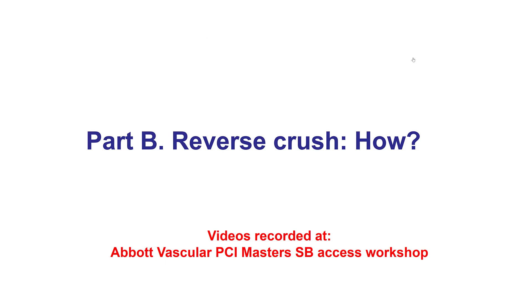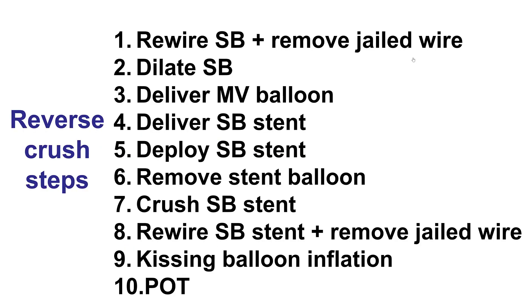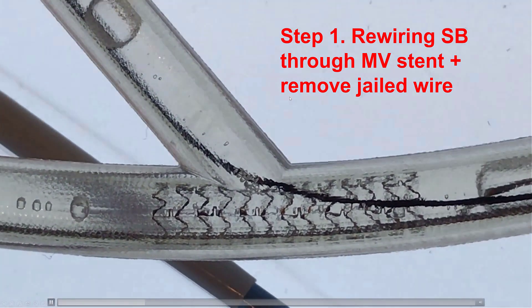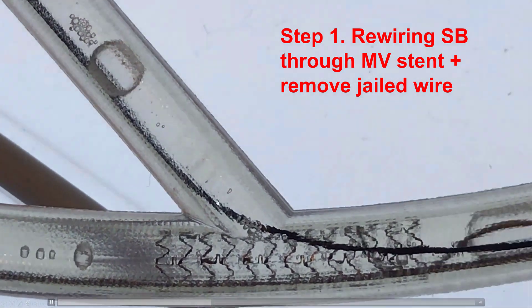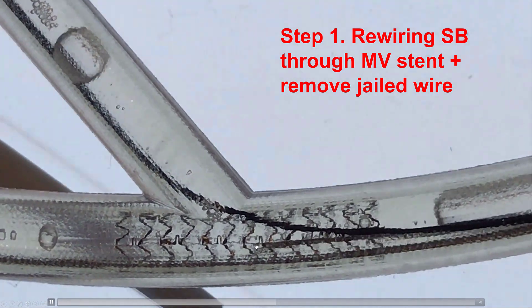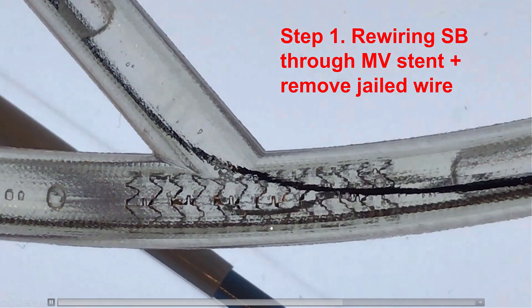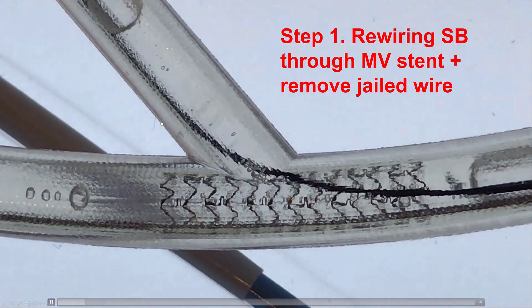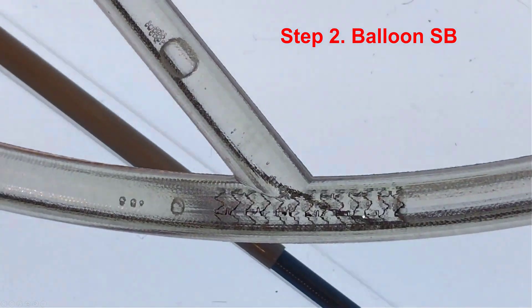We will do a step-by-step description of the reverse crush based on videos that were recorded at the Abbott Vascular PCI Master Side Branch Access Workshop. These are the 10 steps for performing the reverse crush technique. The first step is to rewire the side branch, and this is where the jailed wire can be very useful for guiding rewiring with another guide wire. The guide wire eventually finds its way into the side branch, and then the jailed wire is removed.